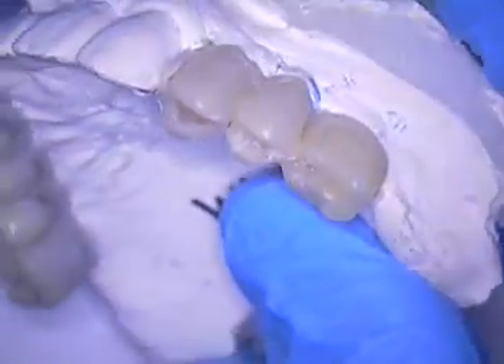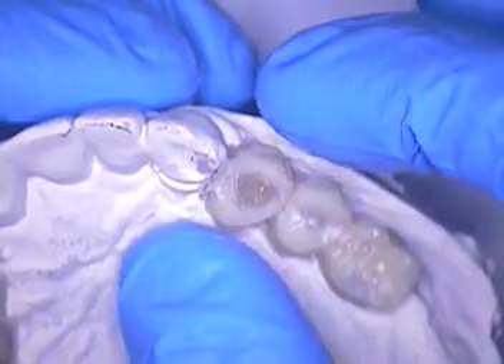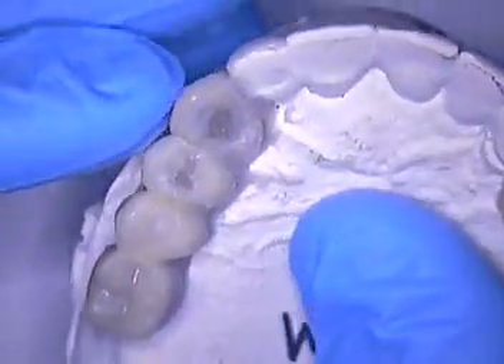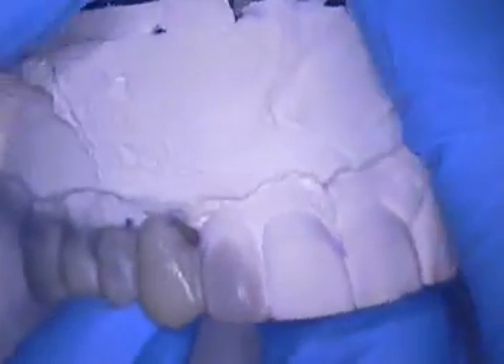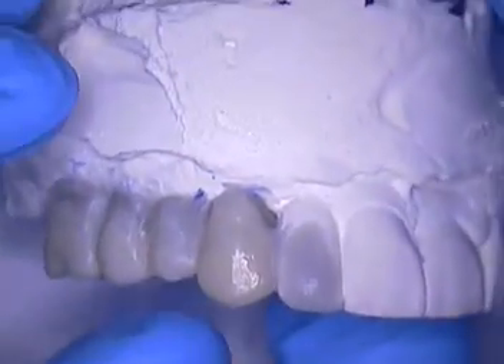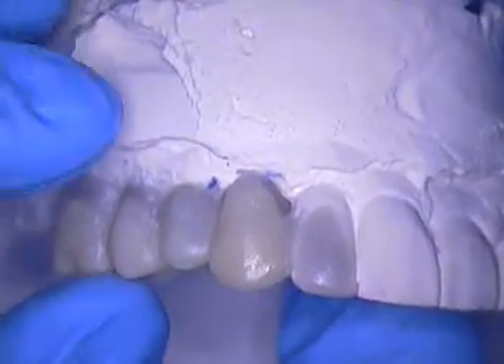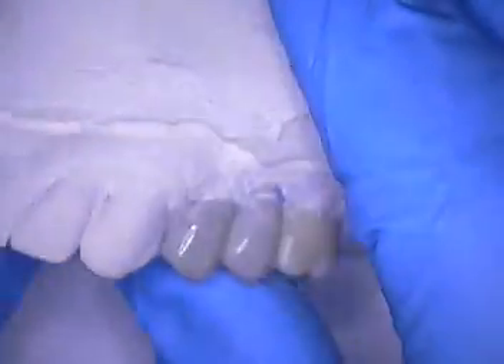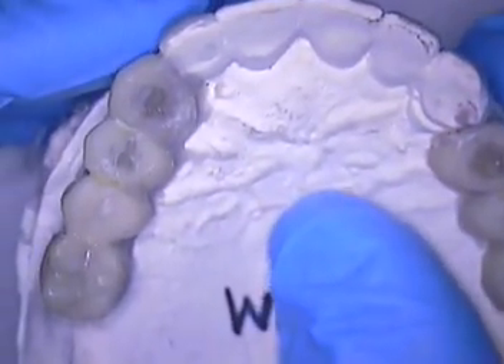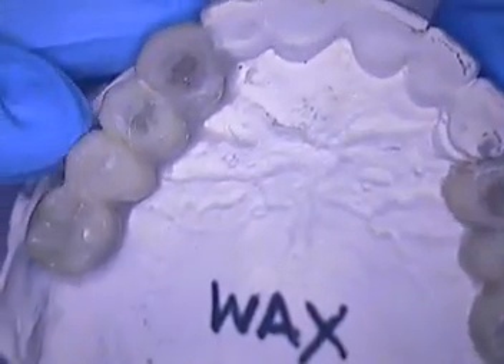A little bit about the wax up. You could just go ahead and get some old ion crowns — this stuff just sits around in my office. Or you can take denture teeth, find the right dimension, measure the buccal-lingual width, and just start setting them in with some utility wax or orthodontic wax. Basically, I'll hollow out as much as I can, articulate the model, add a little wax to some deficient areas — just to give my lab a reference. This cusp needed to come up a little bit higher, so a little wax can be added to that cusp tip. It gives them an indication of where you're going, and it's a very cost-effective way of doing your own diagnostic wax-up.